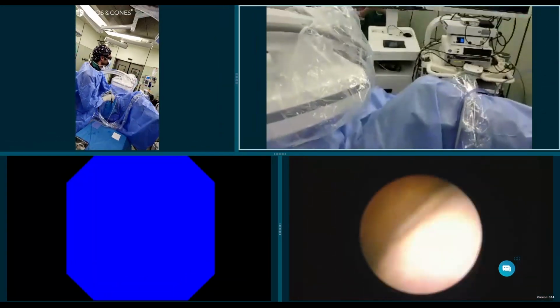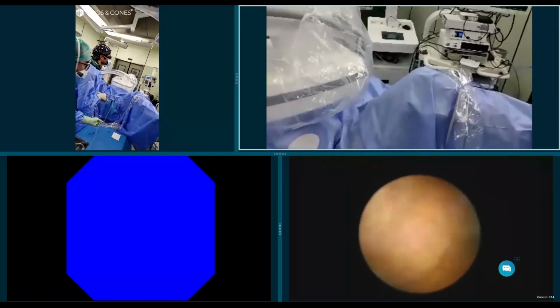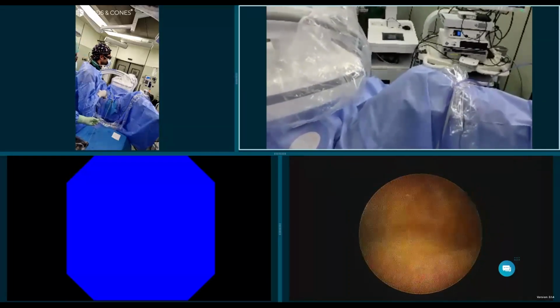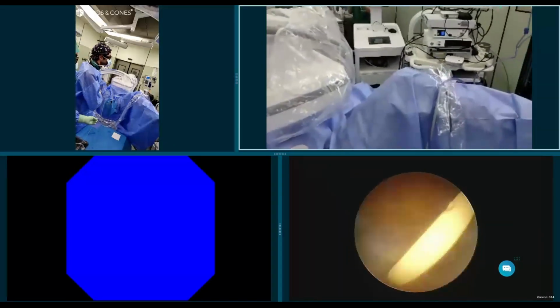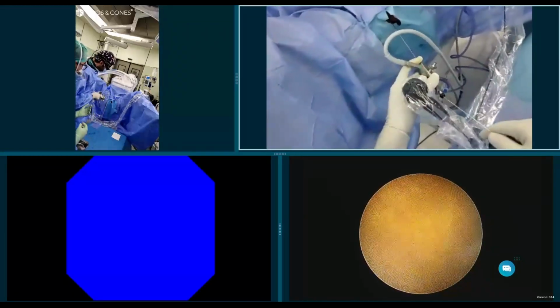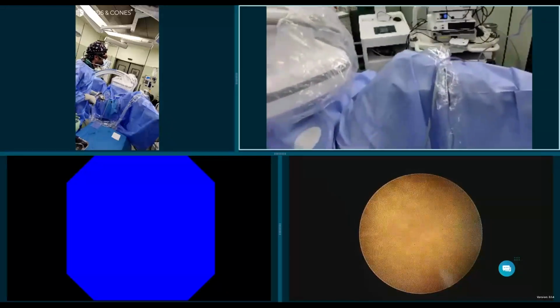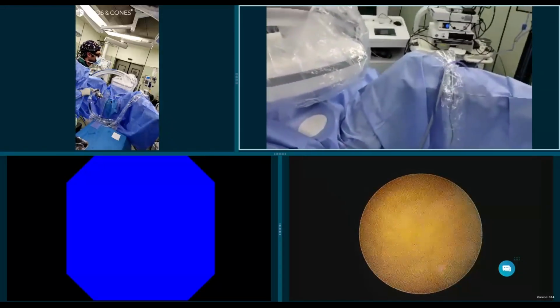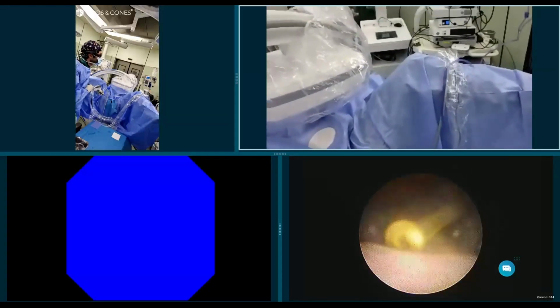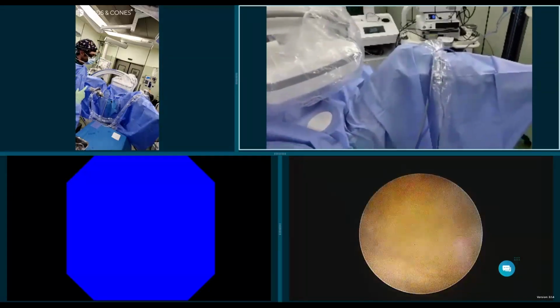Okay. So everything has been pre-checked. We have done the timeout, the checklist, etc. I always like to start with a semi-rigid ureteroscopy to remove the double J and even to check out the ureter always before placing the ureteral access sheath or even the scopes, because what I want is to avoid any damages to the ureter.